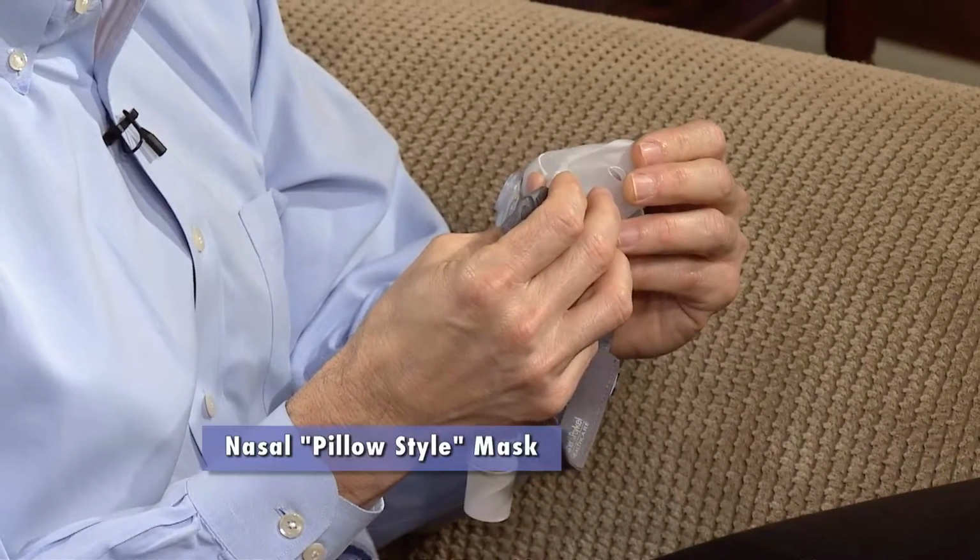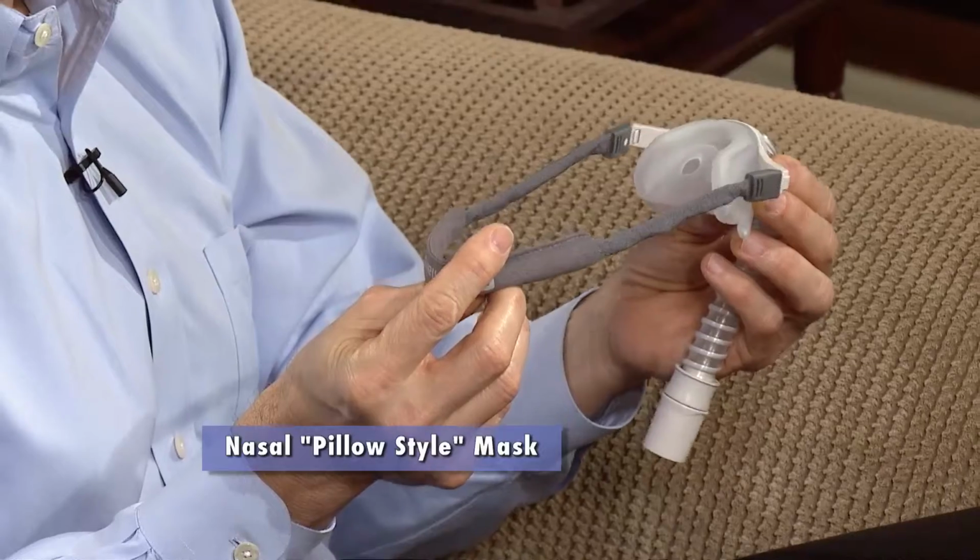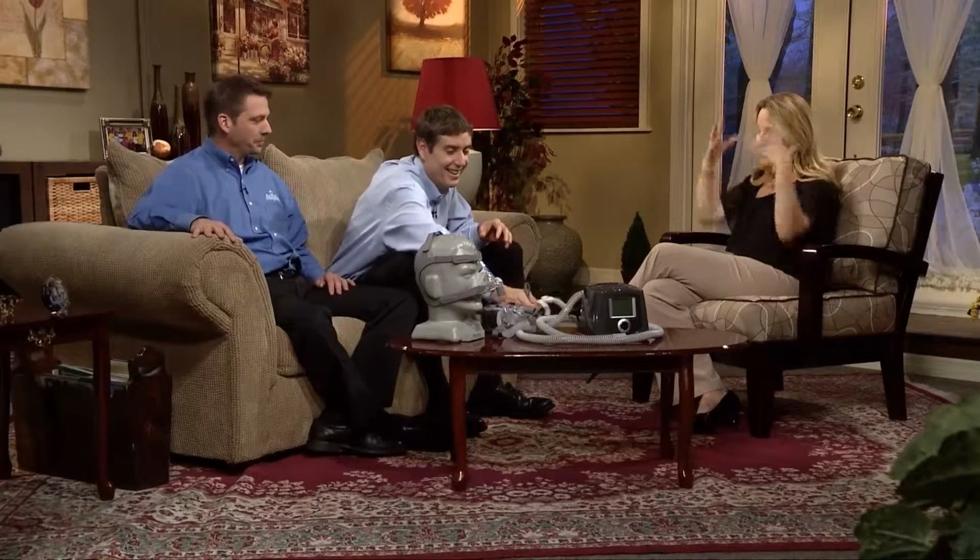Okay. What other masks do we have here? The second mask I brought is called the nasal pillows style mask, and this particular pillows mask will sit right on the nostrils or the nares of the patient's nose. And there's a very minimal head harness for this mask, so patients can easily apply this. And a lot of people like it because it's less obtrusive for the line of sight. So this is another popular way to go. Okay. And you can still watch the active living show while wearing the mask. Right, and it's not over the whole head.